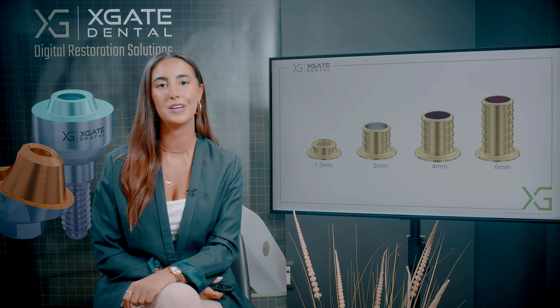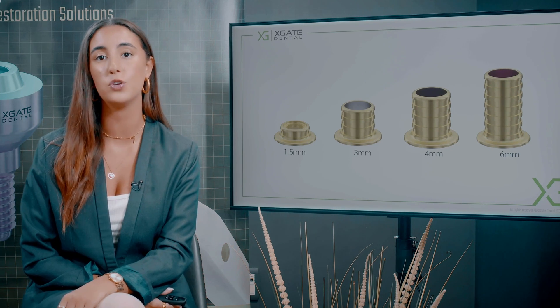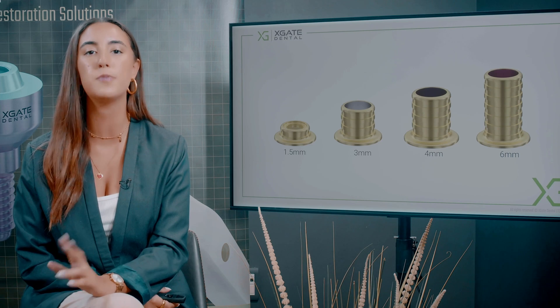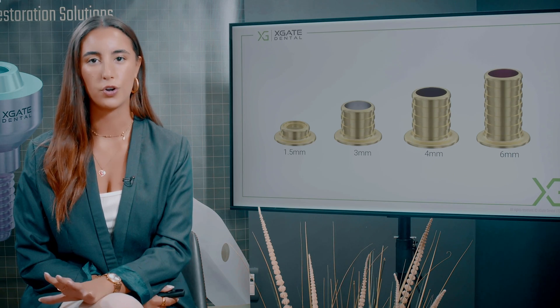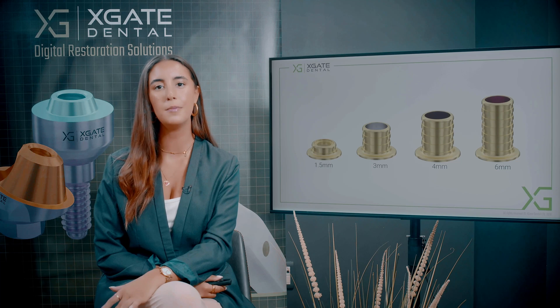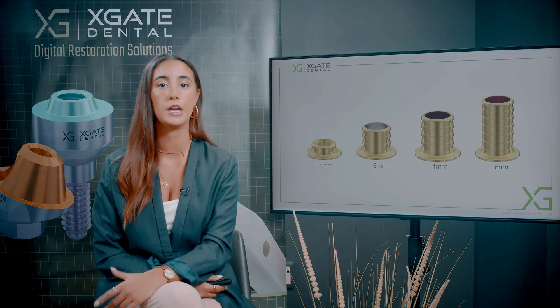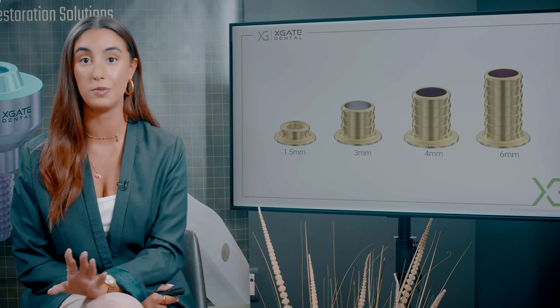Up next you can see the types of sleeves we have for these multi-units. We have different types and each has its own function. The four millimeter sleeve is the standard type used in about 95% of cases — it is enough height for cementation and small enough to make a crown on top. The three millimeter is a bit shorter so you can make a crown with a little less cementation. It will still hold, but because it's quite small you can't make the screw float inside the sleeve like in the four millimeter.